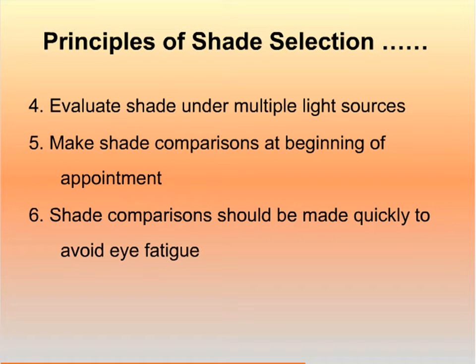Principles of shade guide selection also: you have to use multiple light sources, not only one source. And it's better to take the shade at the beginning of the appointment, not at the end, after having exhausted your eyes in preparation and so on.